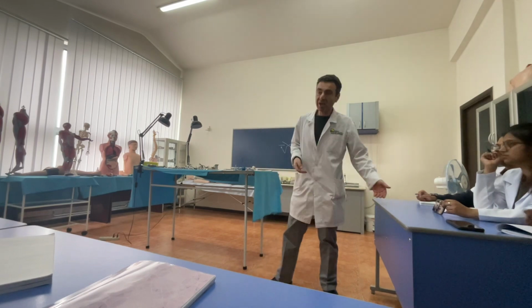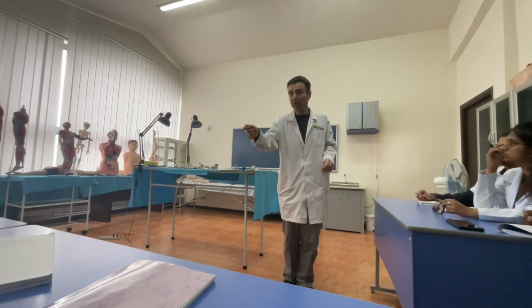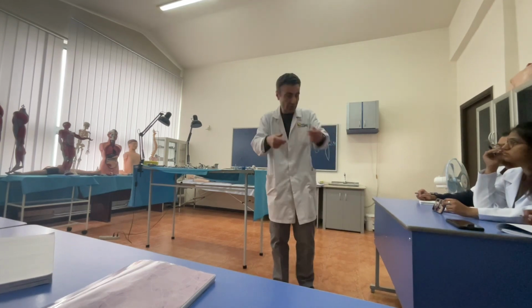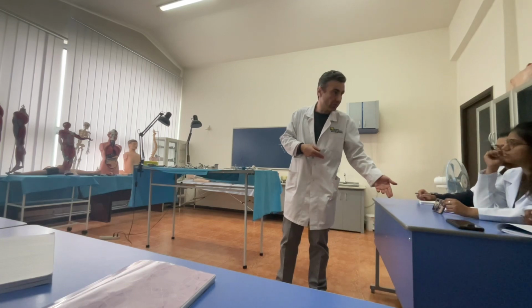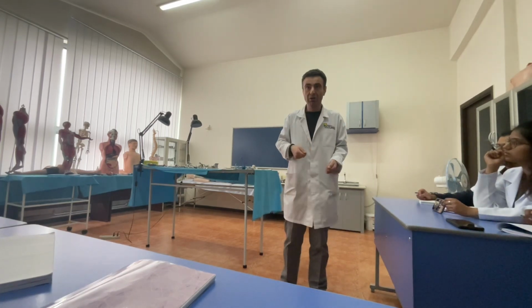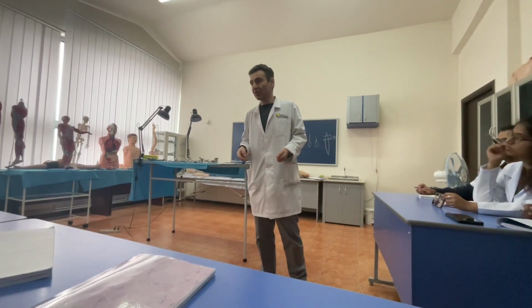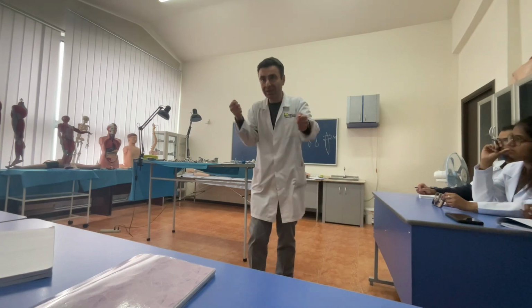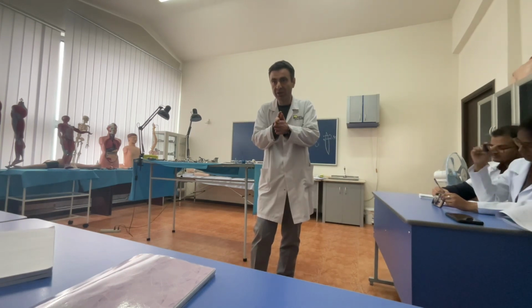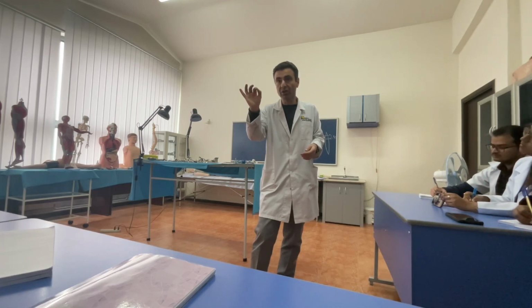What does it mean, permanently arresting of bleeding inside of the wound? It means I can ligate the tip of these vessels, which was previously clamped by the arterial forceps. I can suture. By the way, suturing has two meanings in surgery. It means I suture and ligate the artery and close it forever. Why do we need to suture? To fix the place of ligation.